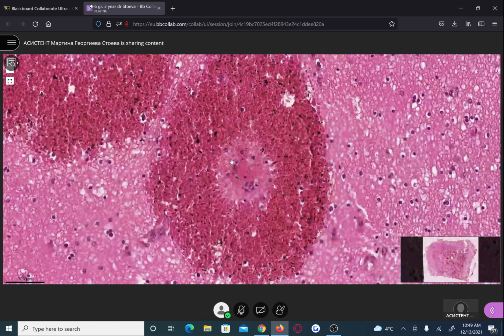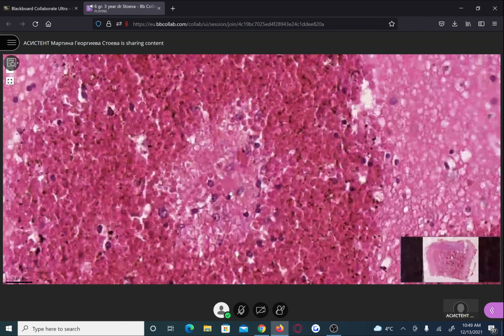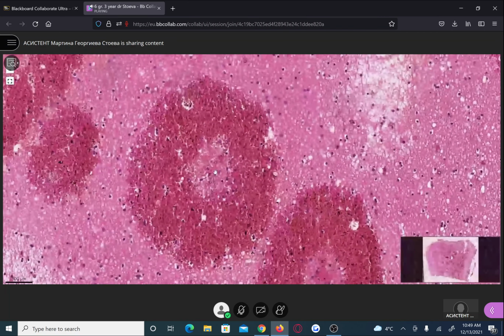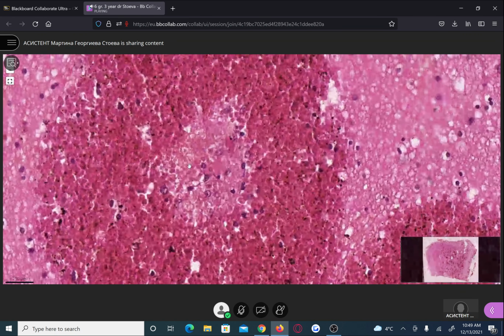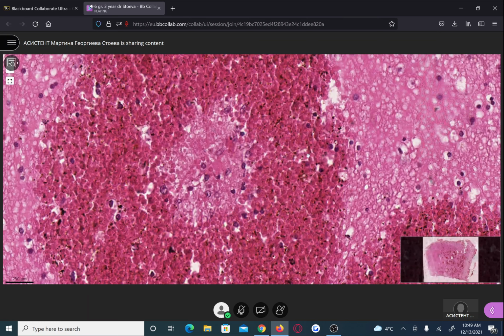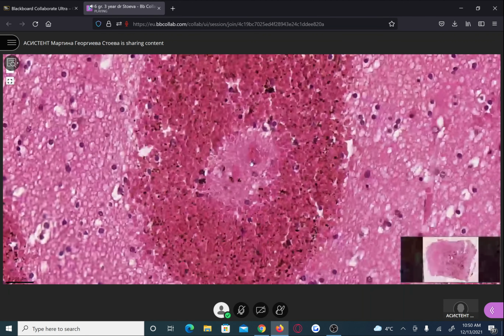The presence of such a small blood vessel, a capillary, in the center of the hemorrhage helps us see the mechanism of hemorrhage. This is the per diapedesin mechanism, which may occur only around the blood vessels in the microcirculation because of the thin wall, where it's possible for the erythrocytes to leave the blood vessel lumen into the surrounding space. Here again, we can find the capillary in the center and then the hemorrhage.